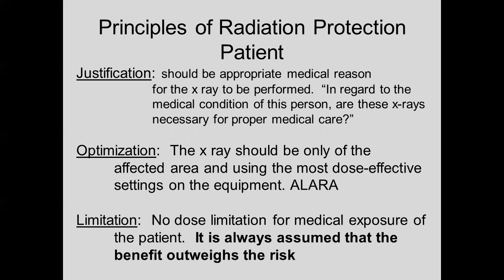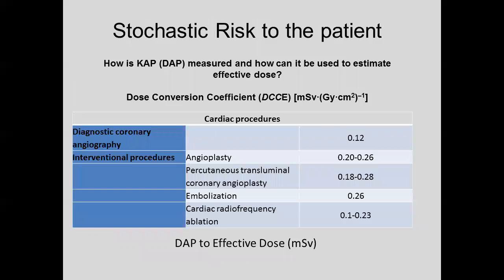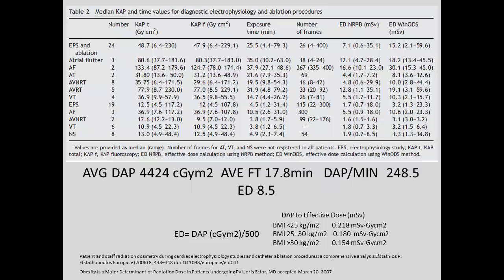So there is no limit to how much radiation you give the patient. You just need to make sure there is justifiable benefit to it. Okay? So, I'm going to skip this one.